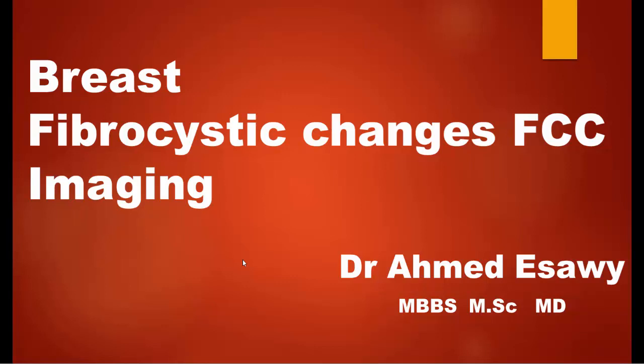Bismillah ir-Rahman ir-Rahim. Breast fibrocystic changes imaging.